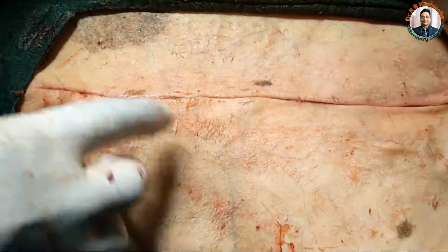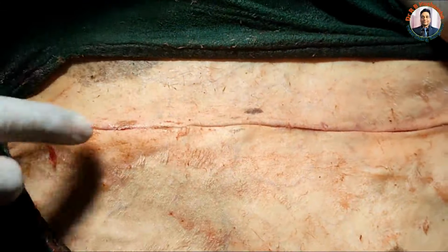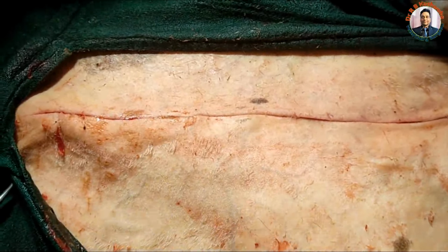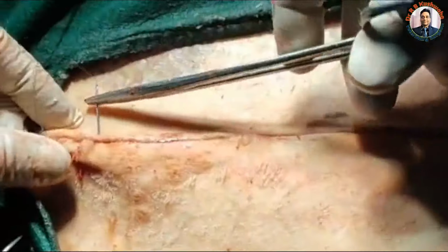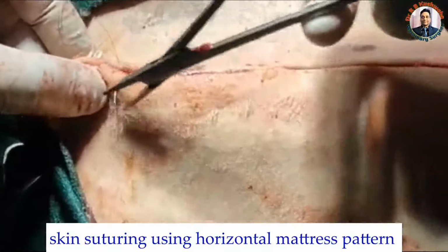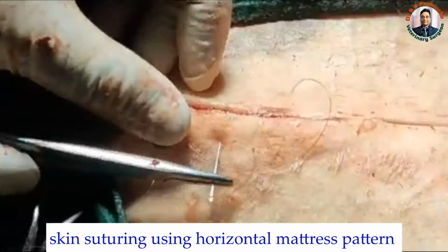So now you could see in this way we applied this subcuticular pattern. So now you could see how the skin edges are close together. So now we go for the horizontal mattress, cross mattress, or simple interrupted. So whatever the suture pattern you like, you just apply it over here. So this is the horizontal mattress pattern.